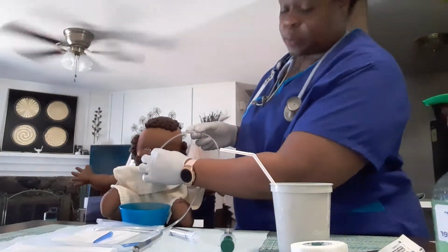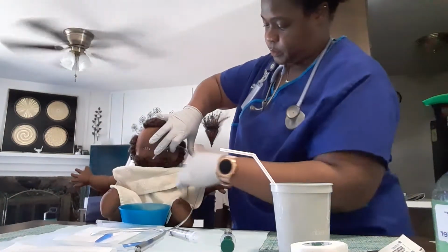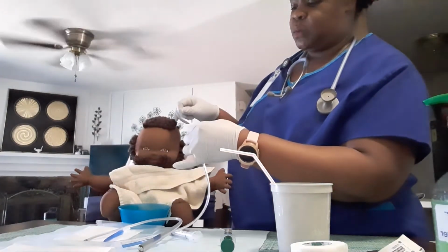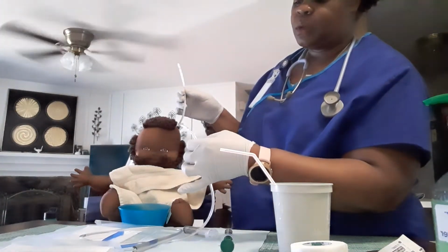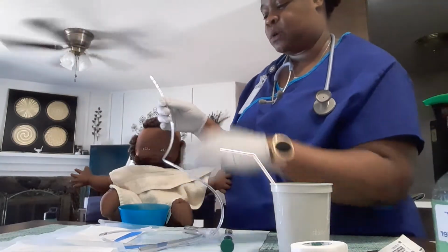I measure from the tip of his nose to his earlobe to his xiphoid process, which is right there. And that has me going down to 35. I would mark this with a Sharpie or a piece of tape, but I do have numbers on here, so I know I'm going down to a 35.